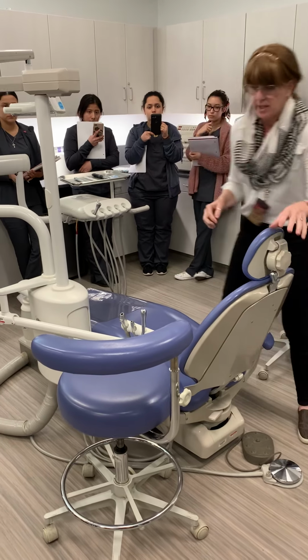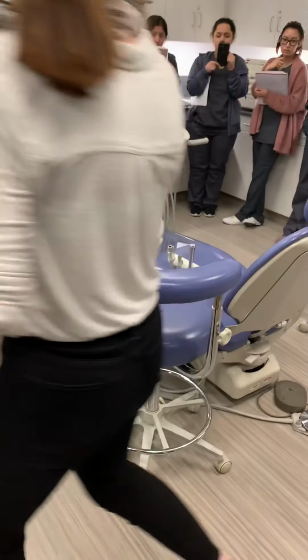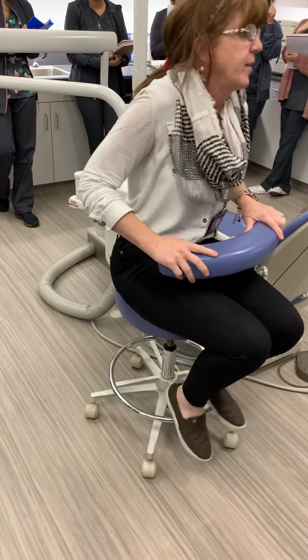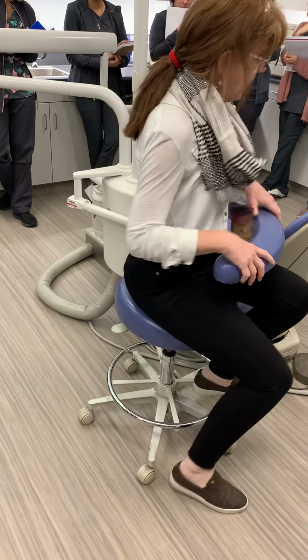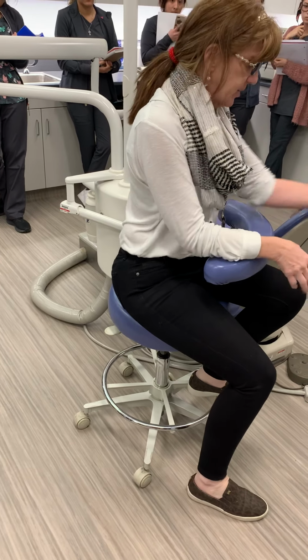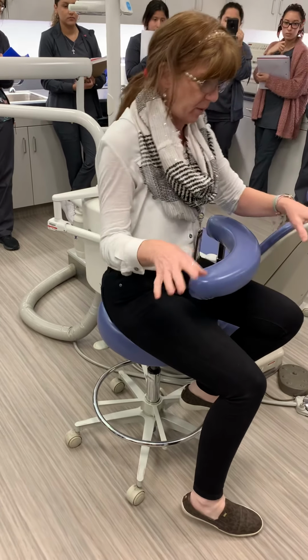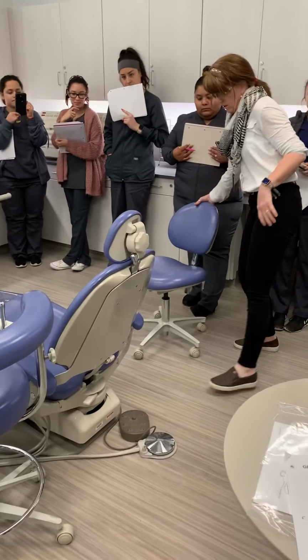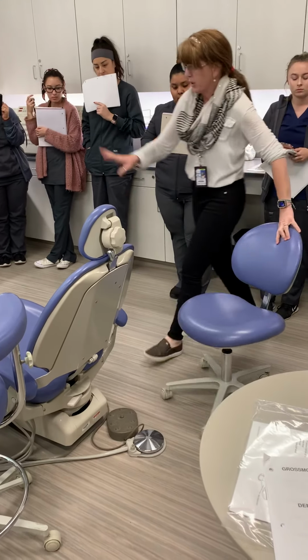We have the assistant's chair, which you're going to sit in. You sit this way, okay? And you turn slightly like this. The doctor is going to sit in between your legs, so don't be weirded out. Okay, this is the doctor's chair. And then I'm going to start with the unit.